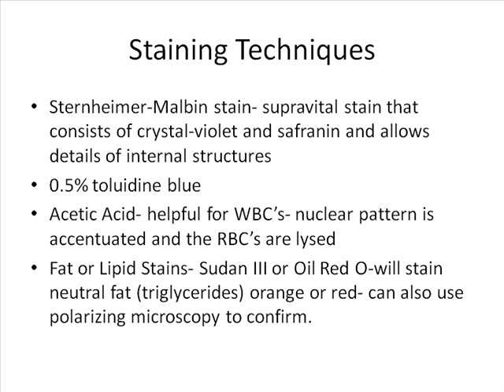Now, the Sternheimer-Malbin stain is the stain that we associate with urinalysis. Some labs use it. Some labs have no stain whatsoever and never use stain. So this is the stain that is associated with urinalysis, such as Gram stain is associated with bacteria or microbiology, Wright stain with hematology, and you can see some of the cells better.